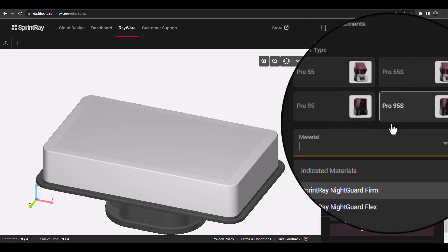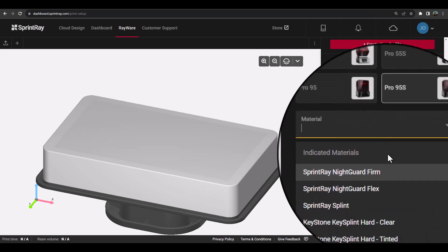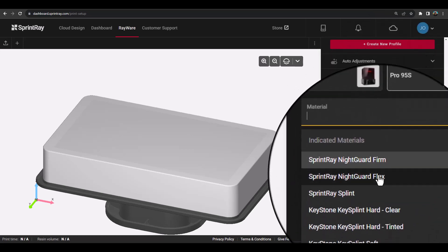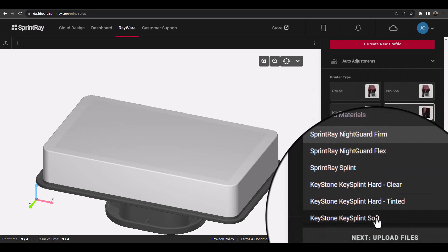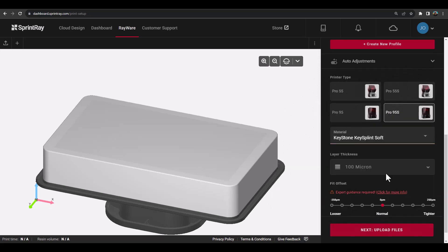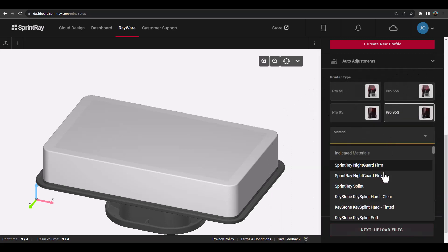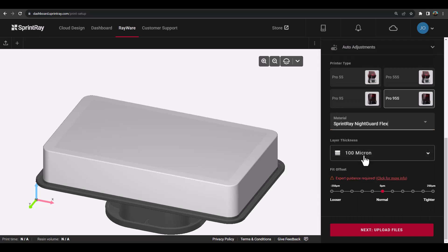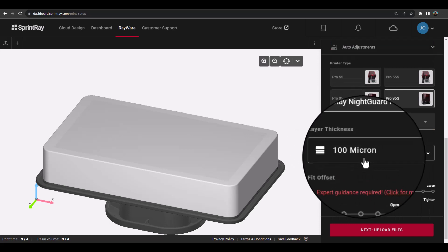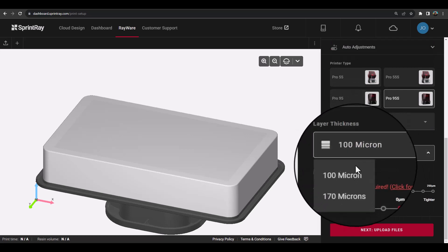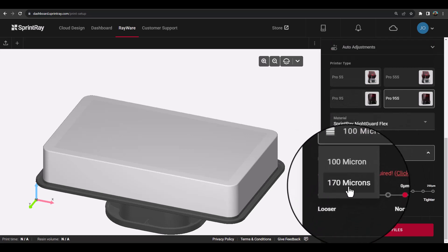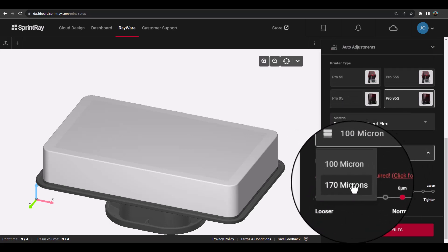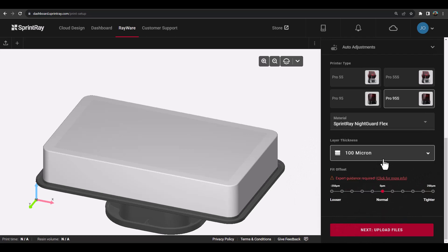Next, choose the type of printer you will be using, as well as the material from the drop-down list, and then choose the layer thickness, which controls the speed and aesthetics of the print. The fitment offset tool should only be used if instructed to by SprintRay technical support.